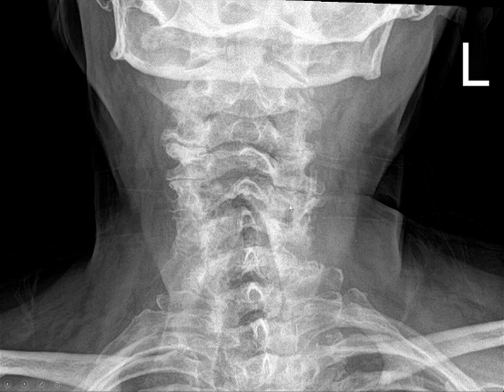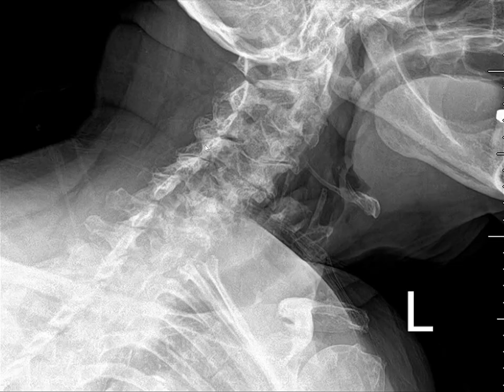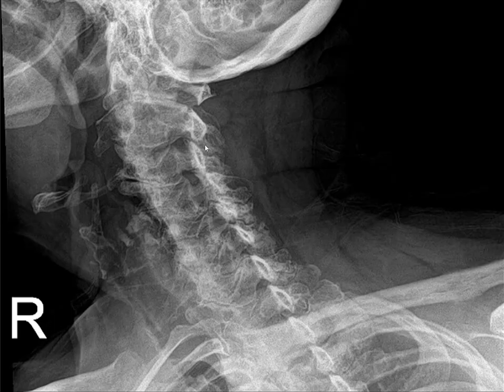On the AP view, there are large osteophytes emanating from the facets from C3 to C7, and you can see the facet joint en face because of the alignment of her cervical spine, and the angle goes right through the facets because she's basically leaning forwards. The oblique views are non-contributory.